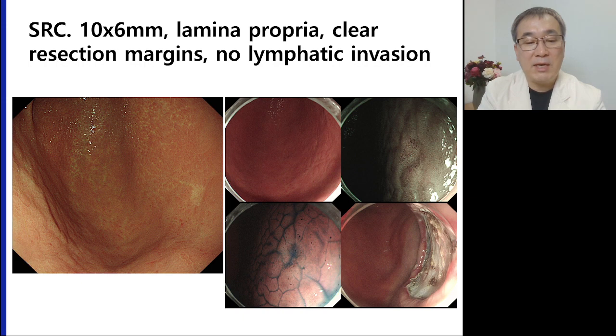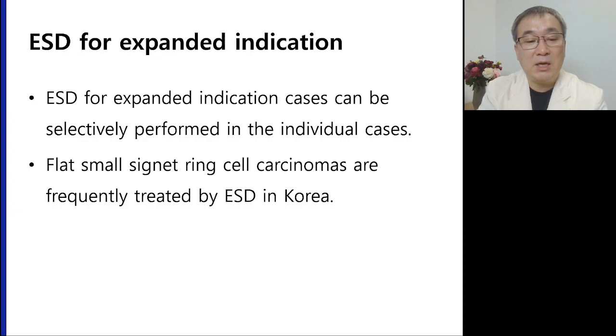I performed ESD and the final pathology was a signet ring cell carcinoma, 10 mm, limited in the lamina propria layer, clear resection margins, and no lymphatic invasion. ESD for expanded indication cases can be selectively performed in the individual cases. Flat, small signet ring cell carcinomas are frequently treated by ESD in Korea.